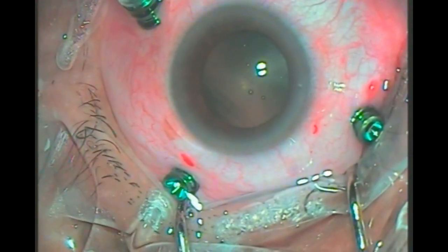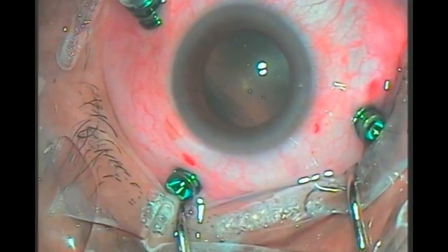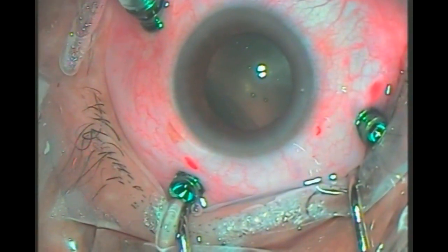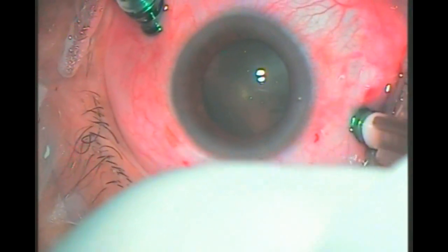Let us look at the bubble-assisted anterior vitrectomy with another example. This maneuver is not only helpful in reducing the intraoperative lens touch and primary PCO formation, but also helpful in training new residents and fellows a safe way of anterior vitrectomy.